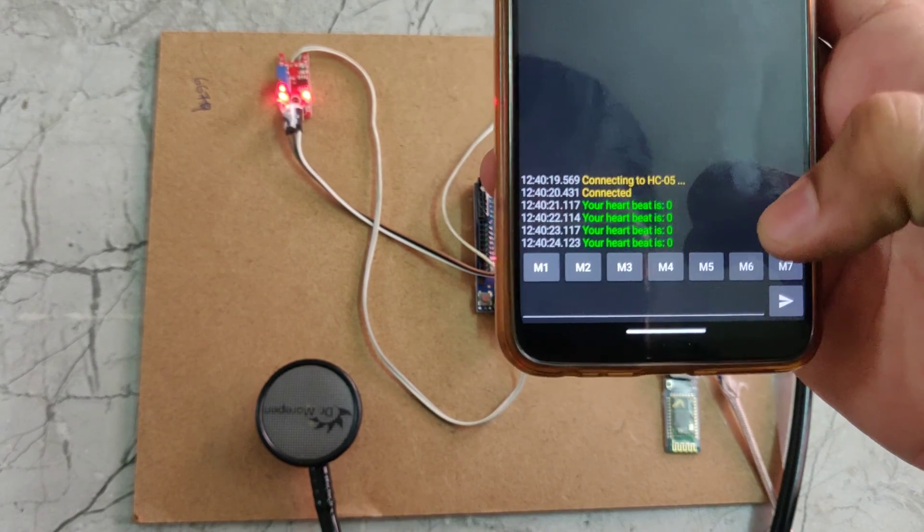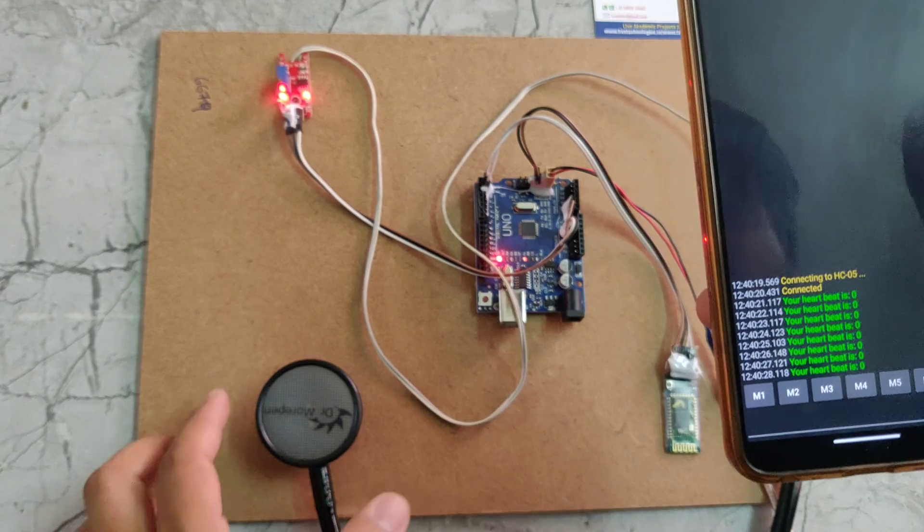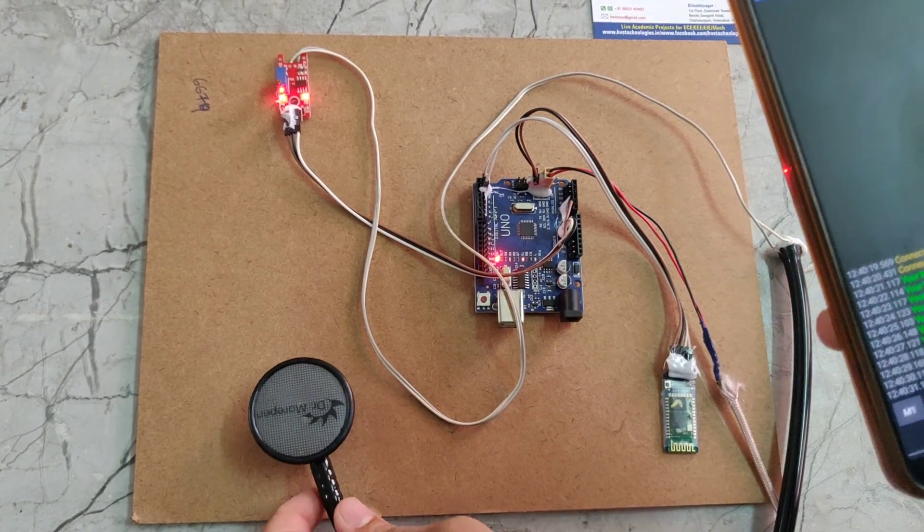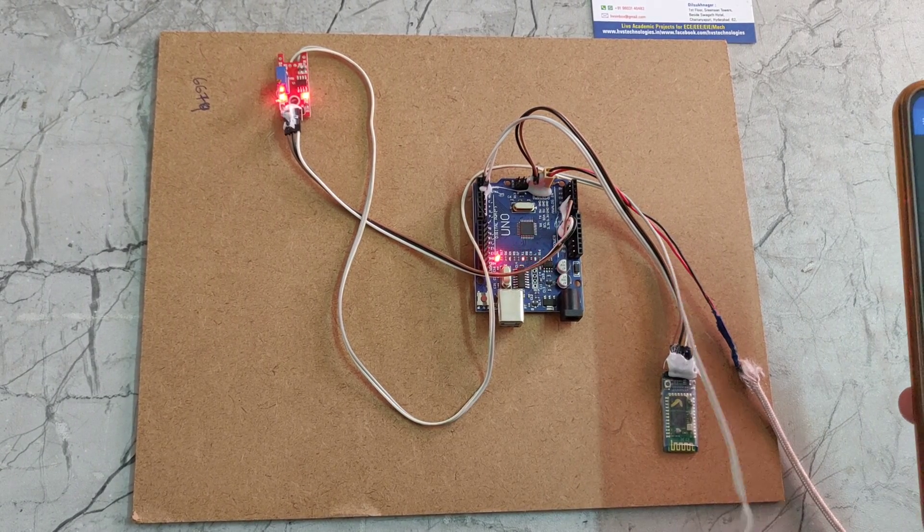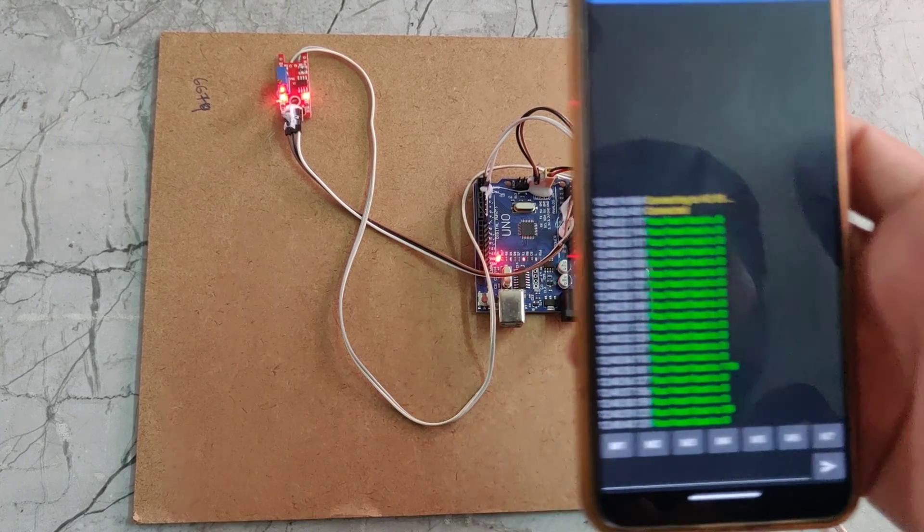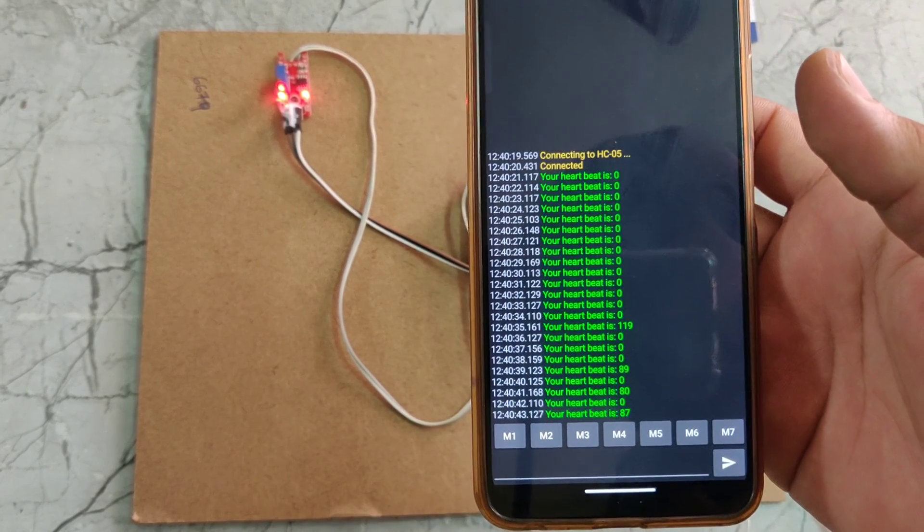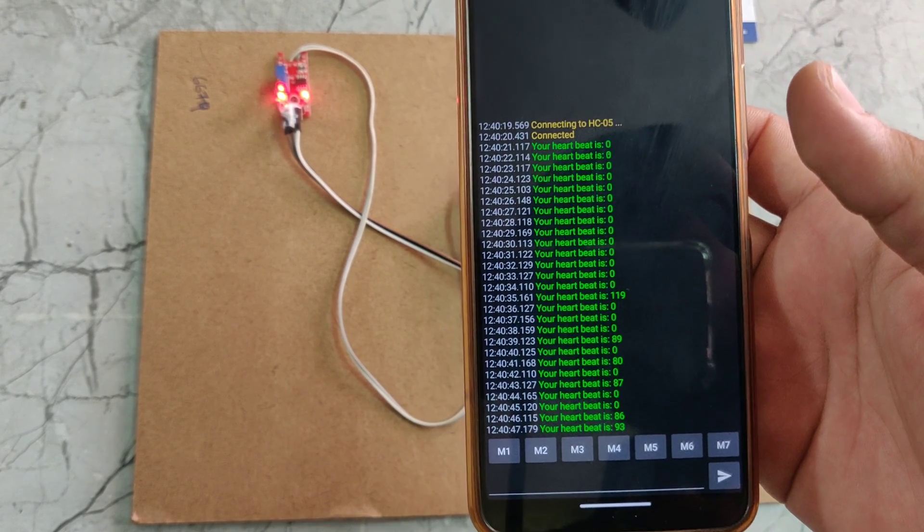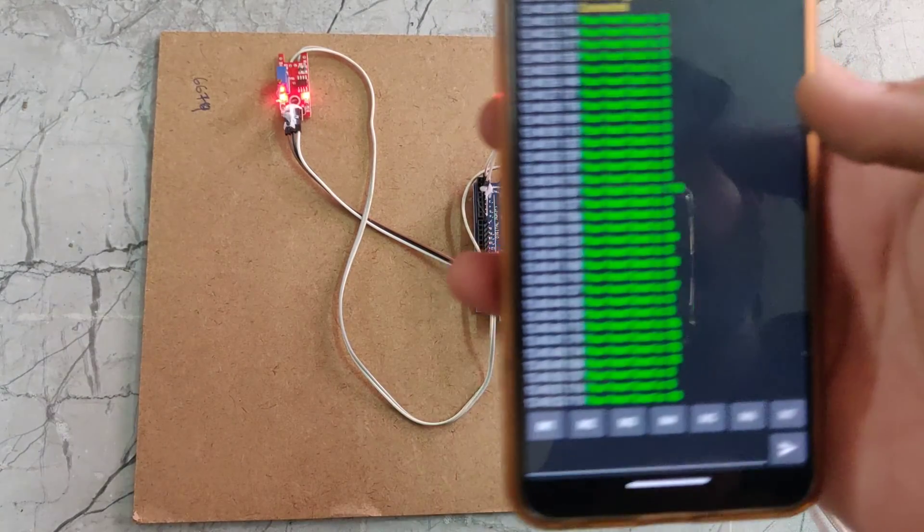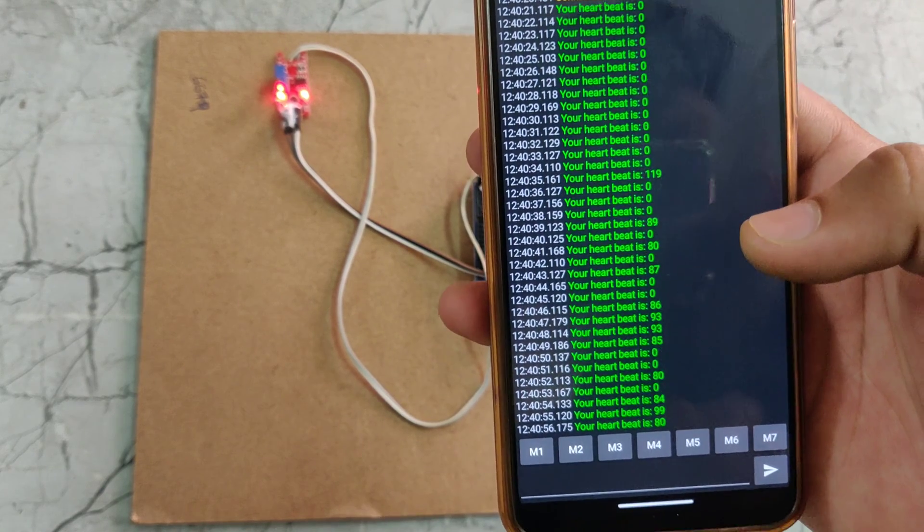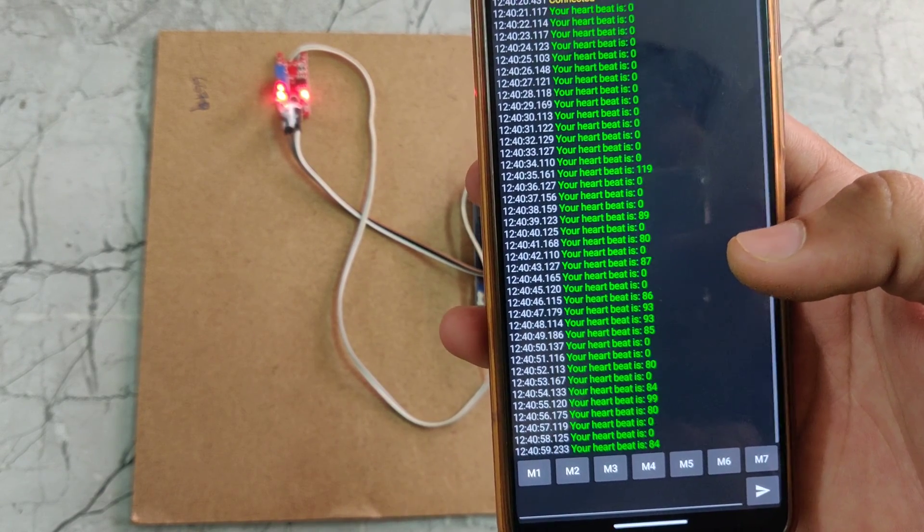It is showing the heart rate is 0 because we don't attach it to our heart. Now I am attaching to my heart, then it will show the readings. We can see it is showing 80, 87, 86. This is my heart rate, 80 to 90.